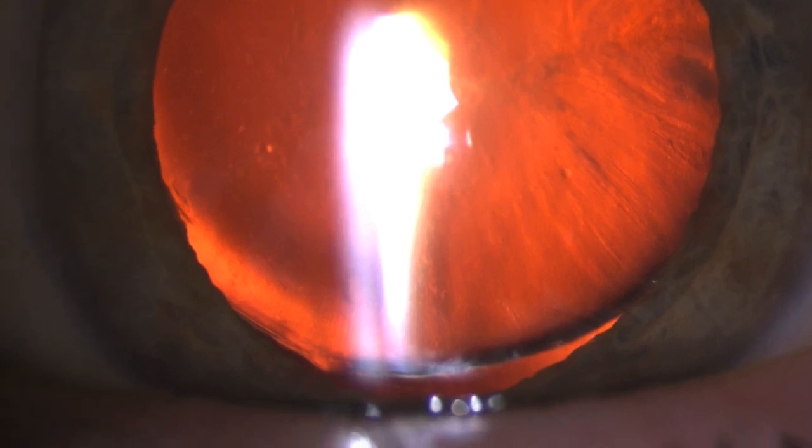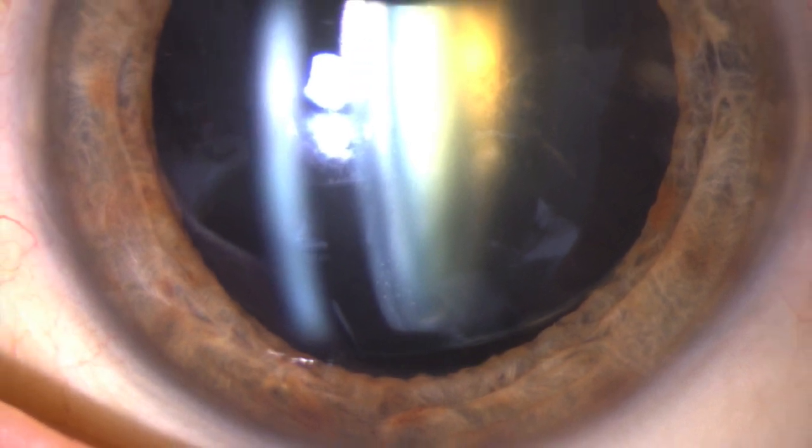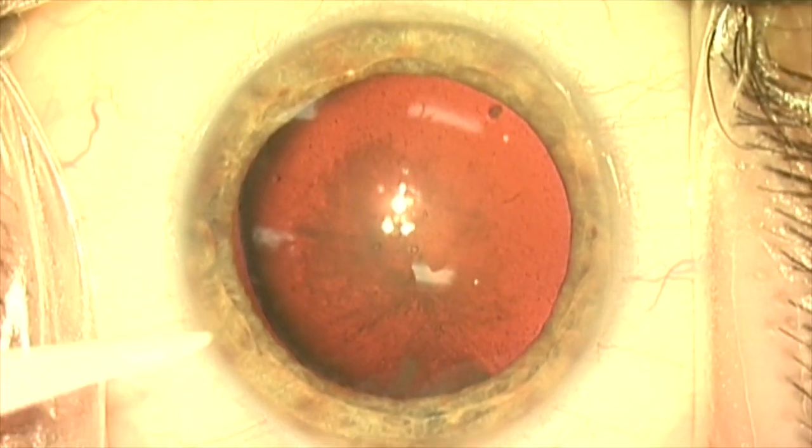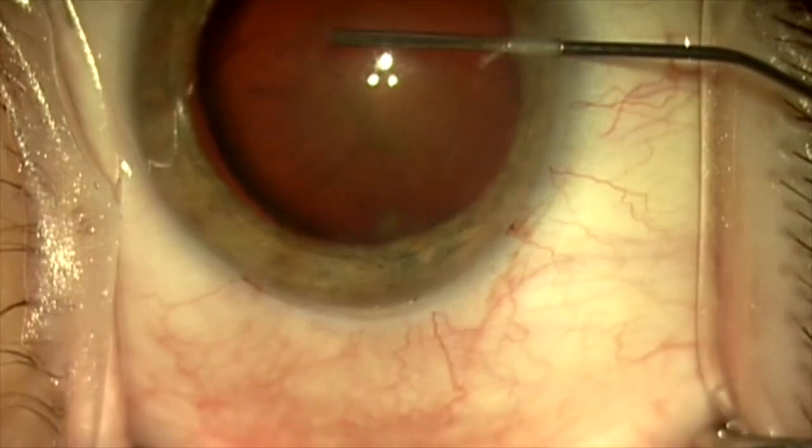This is a 73-year-old woman referred for ectopia lentis. She has phacodinesis, a big zonular dialysis down at 6 o'clock, and a rather dense cataract. The vision is 20/200 in this eye.